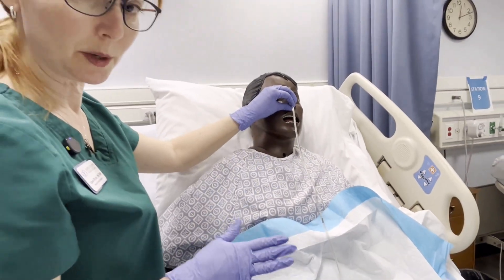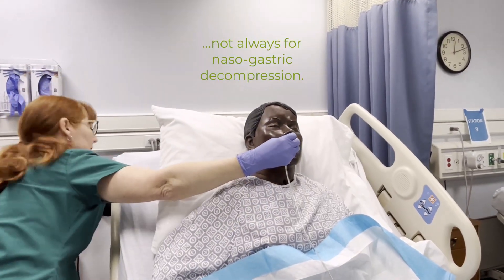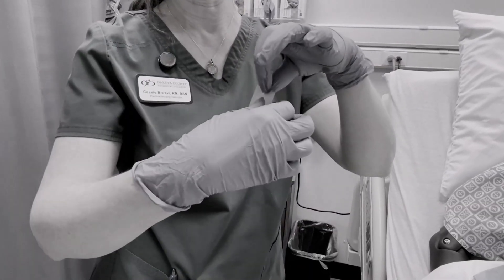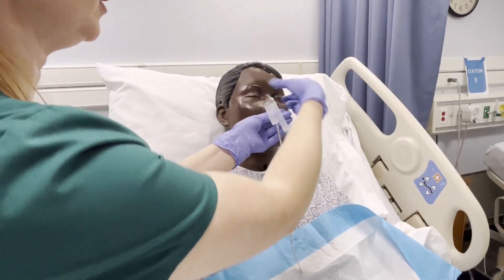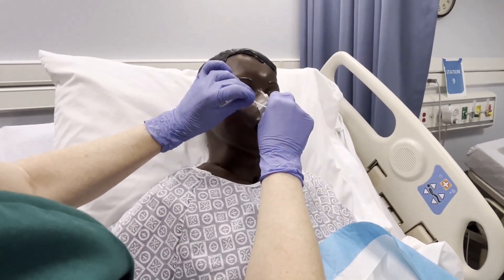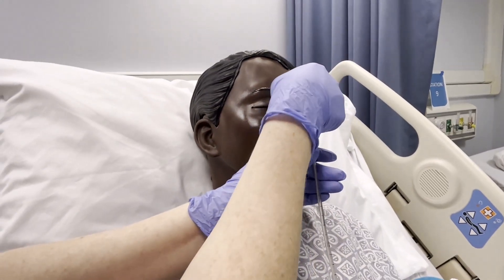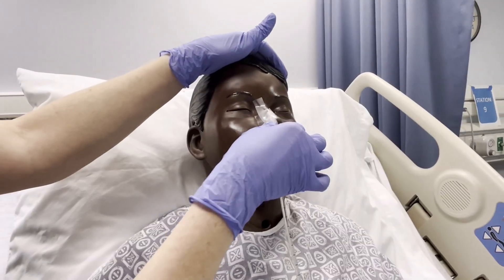This needs to be x-rayed before it's used to make sure it's in the right position. I'm going to grab some tape — just a strip — and make what I call a pair of pants by splitting the tape. That way it's ready to tape onto the patient. I'll place the tape on the bridge of the patient's nose, wrap it over the tubing, and tape it back up. I don't want the tube to irritate the nasal opening or cause skin breakdown by being too close to the edge of the nostril.